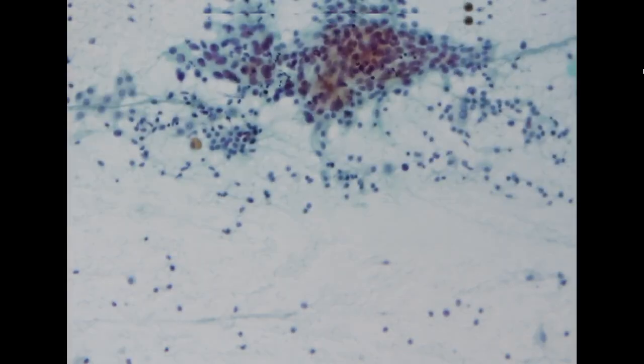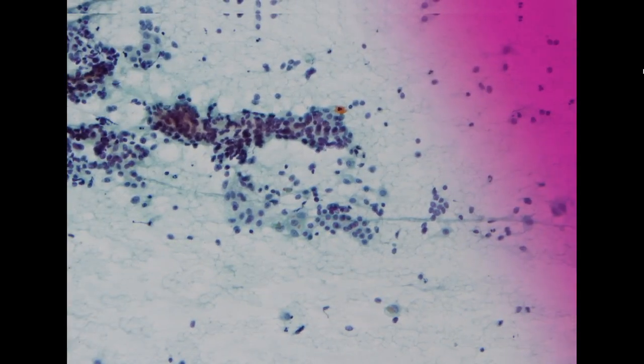In this smear, there were very scant superficial keratinized cells, and a little bit of blood as well. At that time, we also called this specimen ASC-US. But this year there seem to be more of these keratinized atypical cells.